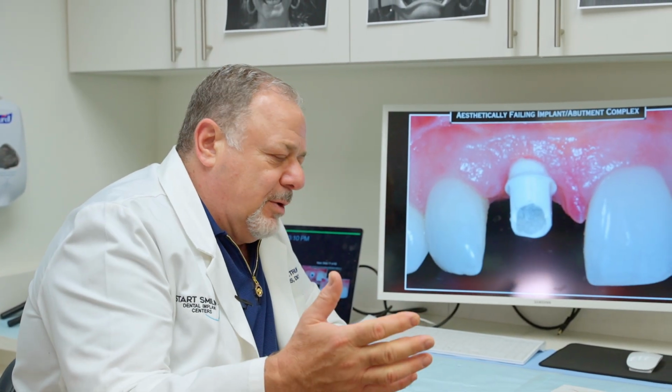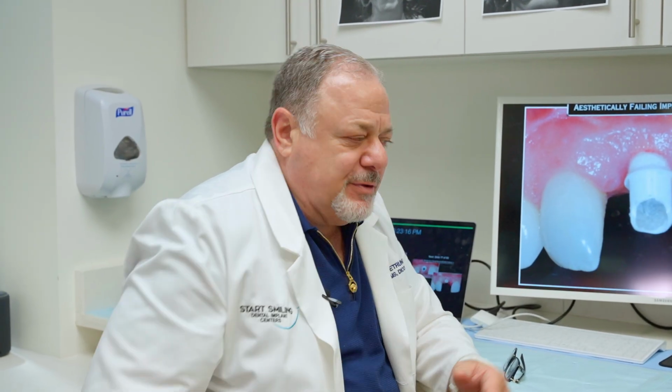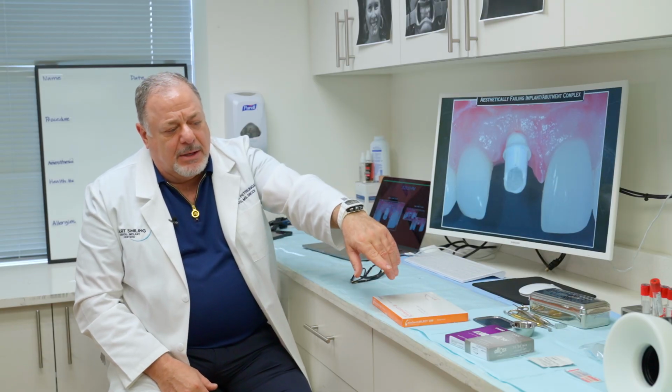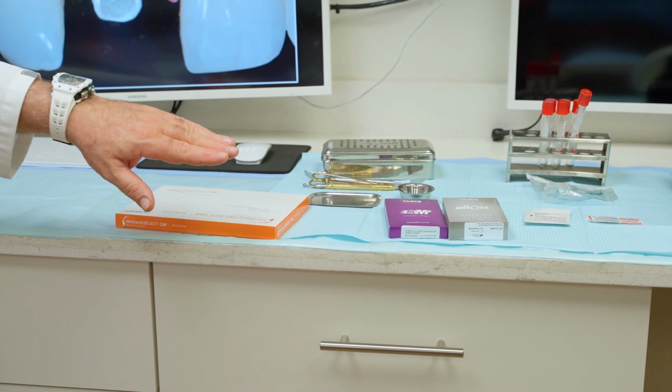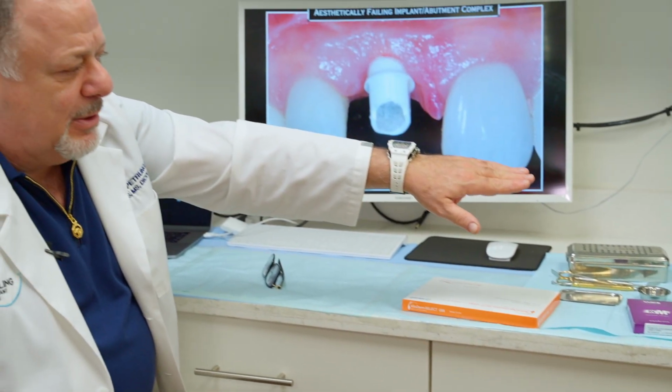So henceforth the replacement. Before we start, we're going to get some blood from the arm. We're going to be doing our PRF, so you can see our tubes are here and our blood harvesting kit, okay? Now we also have our grafting complex out, which will be a mineralized cancellous 1 to 2 millimeter particle size graft complex that we'll be mixing with the PRF.